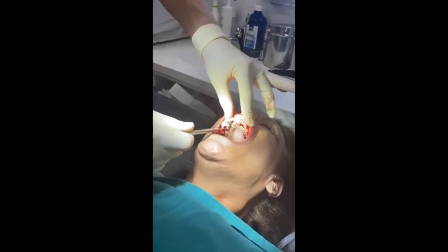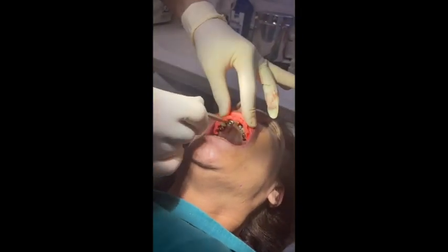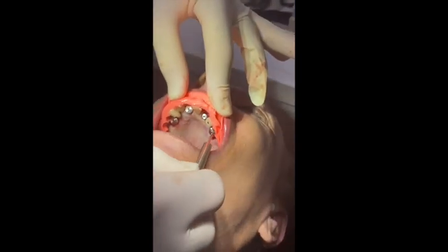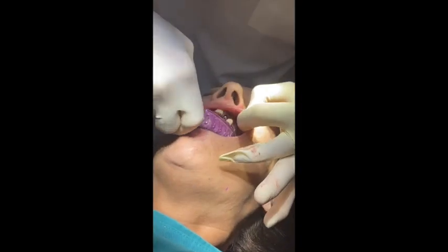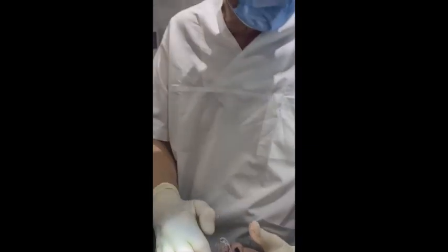First bicuspid, lateral incisor, central incisor, lateral incisor, first bicuspid — okay. It's all screw-retained. We take an impression now for the lab so the lab knows where the implants are.